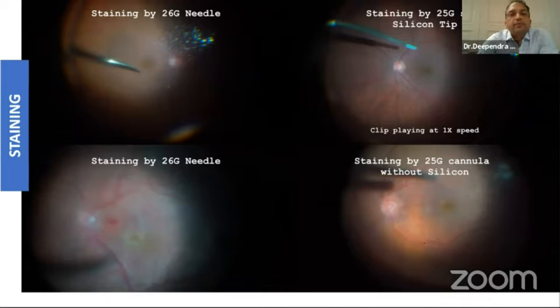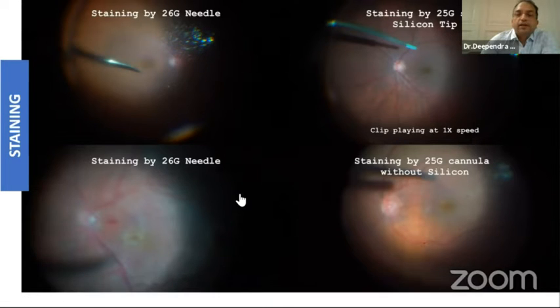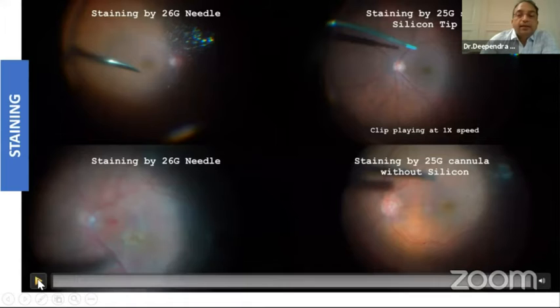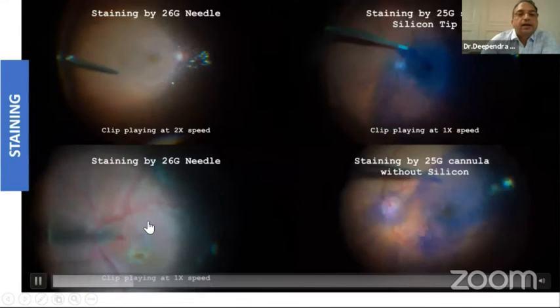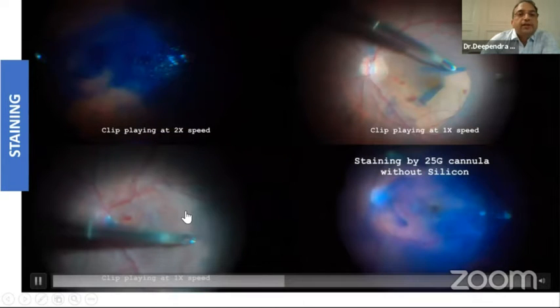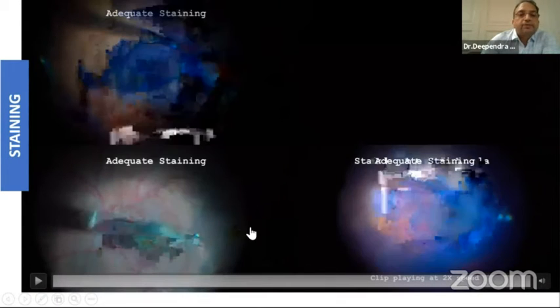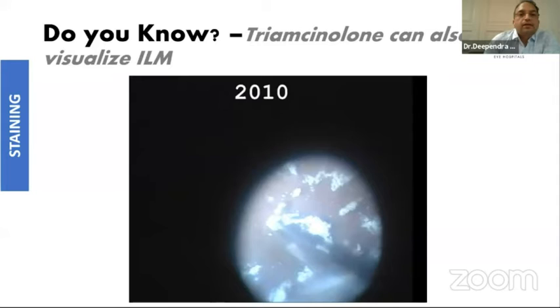Another tip: many times you don't get a good quality silicon tip. You can very easily use a 26 gauge needle instead. The biggest advantage is it is almost always available, you can use a new one every time, and another advantage is it will not drag the vitreous when you are introducing it into the vitreous cavity. The staining you get — even if it is not reaching very close to the retina — is good enough. You can see on the left side staining by needle and on the right side by soft tip — quite comparable.